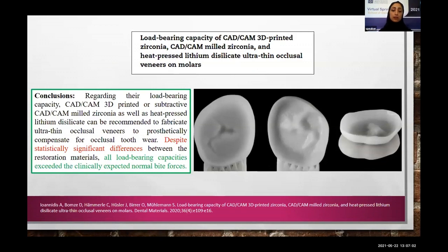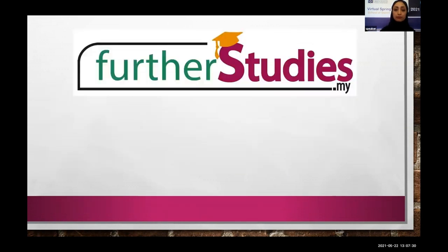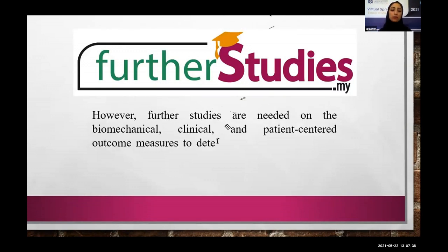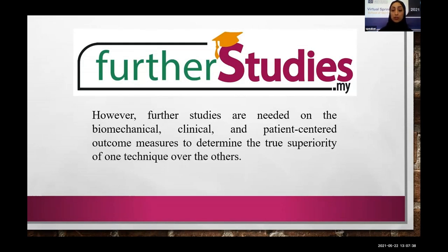And beyond this, another study evaluated the load-bearing capacity of CAD/CAM 3D printed zirconia, CAD/CAM milled zirconia, and heat-pressed lithium disilicate ultra-thin occlusal veneers. Despite a statistically significant difference between these groups, all the groups showed a capacity exceeding the clinically acceptable normal bite forces, so all the groups are acceptable. However, it's obvious that further studies are needed on the biomechanical and clinical properties of this technique to determine the superior technique.